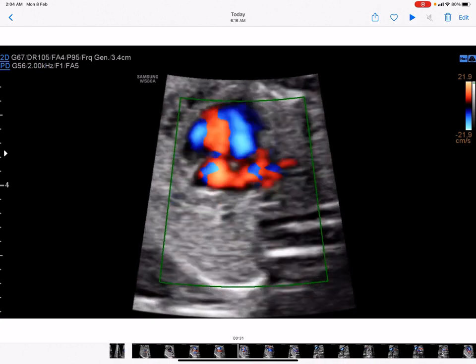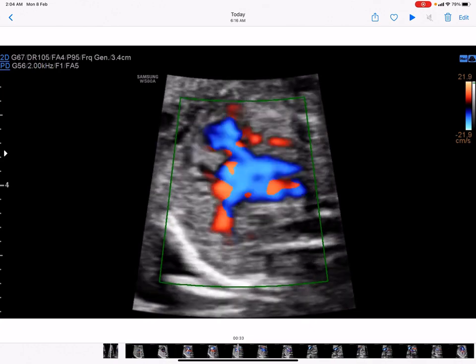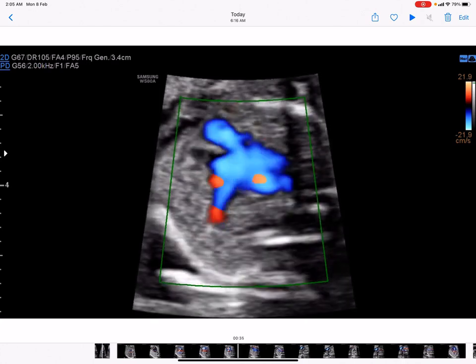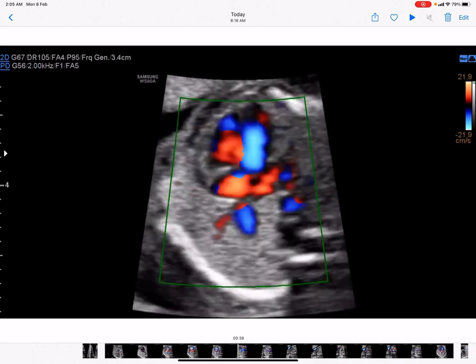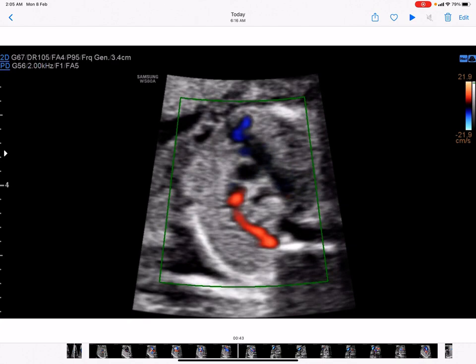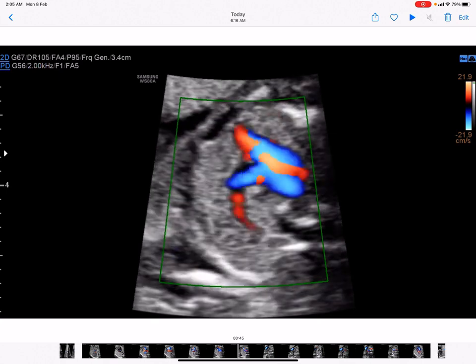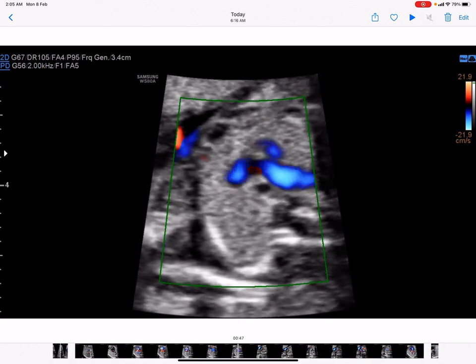This is the preset, a low velocity PRF, a low PRF, which is used to see the pulmonary veins. That is the PRF which we use for the aberrant right subclavian artery as well, to rule out aberrant right subclavian artery. Okay, so this is how we go ahead and try to reach the 3-vessel view. So this is the 3-vessel view. I hope you can see it. This is the 3-vessel trachea view.